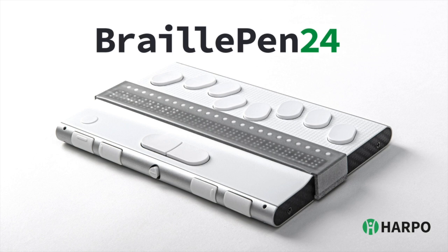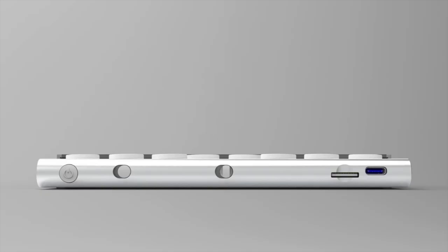BraillePen 24 allows blind computer and smartphone users to access and input information on these devices and fully operate them using screen reading software. The user reads from the 24-character Braille display on top of the device and uses the Perkins keyboard to type and navigate. Some Perkins key combinations represent characters, and some, usually a combination of the space key with other keys, are used for commands. When BraillePen 24 works with a screen reader software, this mode of operation is called terminal mode.